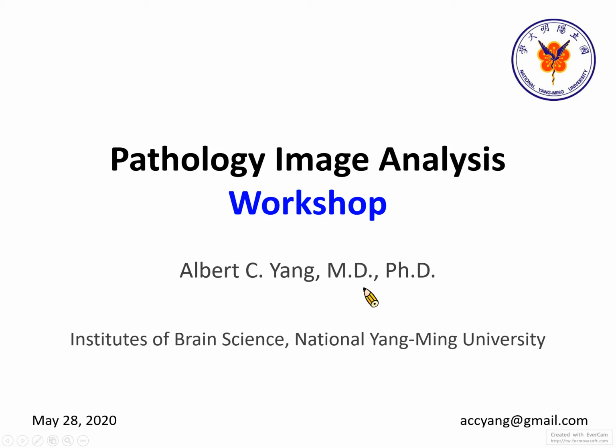Okay, so following the lecture parts of the pathology image analysis, we move on to the workshop. It's a very exciting part of the course, because I know some of you may be nervous about the case presentation too. Then how to write some code to differentiate the skin images, to differentiate the nevus and the melanoma.